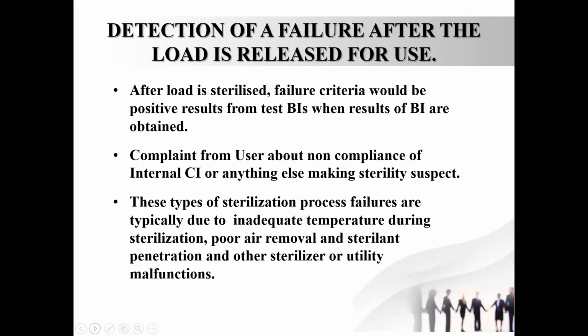After the load is issued, how do we detect that it has failed? That is mostly positive results from test BIs, whenever the results of the BI are obtained. Now, this could be even after a couple of days and the load has already been released.